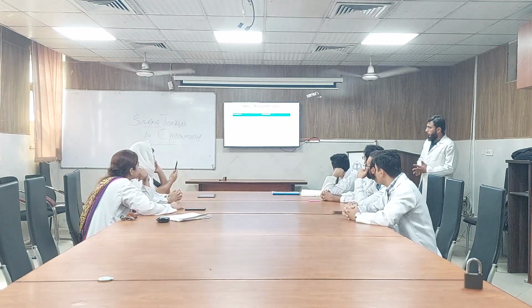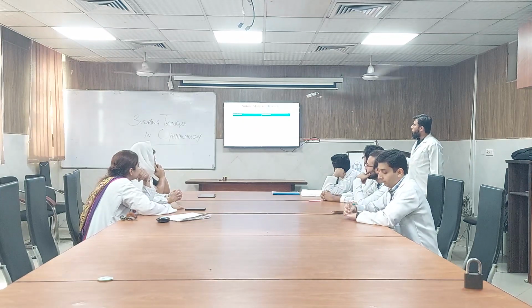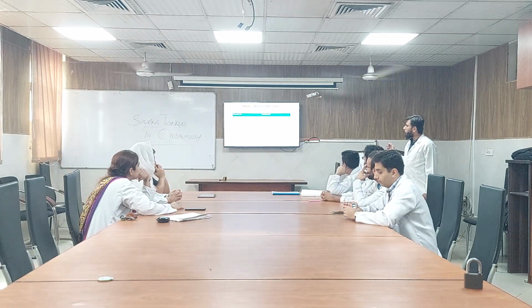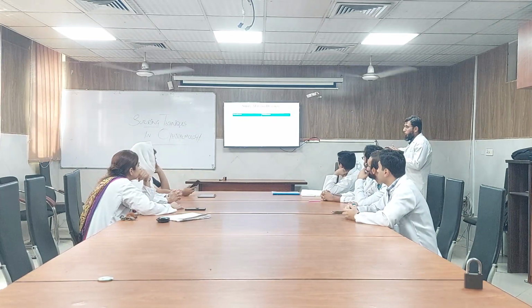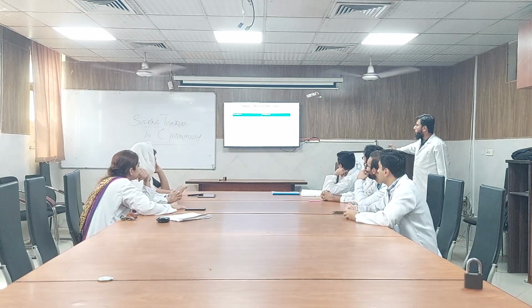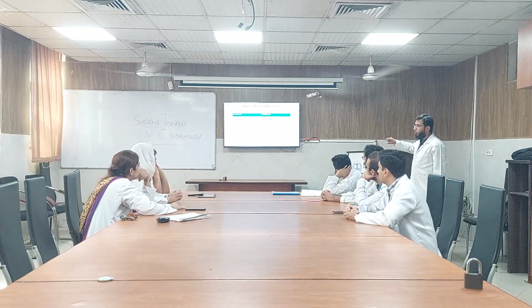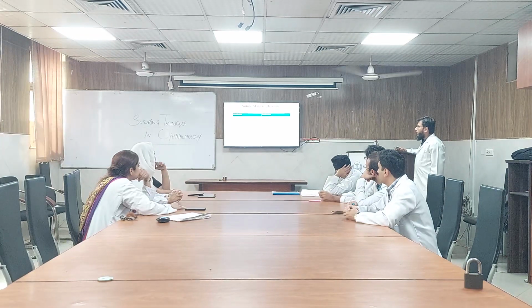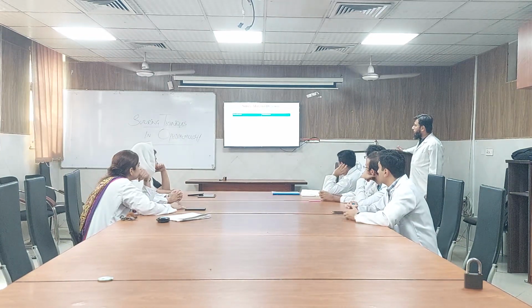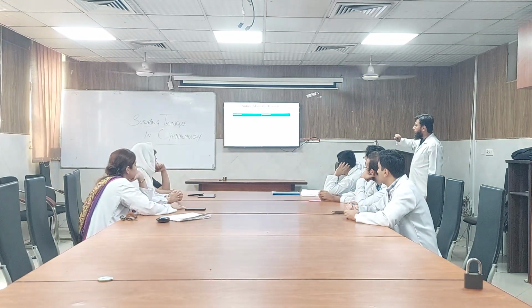Now, there is another differentiation, between monofilament and multifilament sutures. The monofilament suture is usually smooth, multifilament is porous. Monofilament suture does not support bacterial growth, as in the multifilament there is a potential space which acts as a nidus and helps in the growth of the bacteria. There is no capillary action with the monofilament, but capillary action is present within the multifilament, for the same reason, that there is a potential space present within the different parts of the thread.